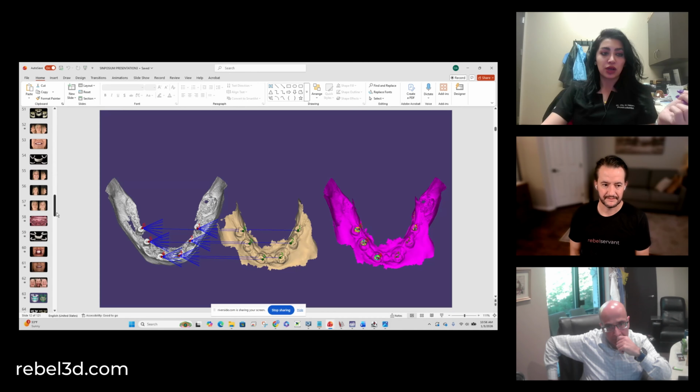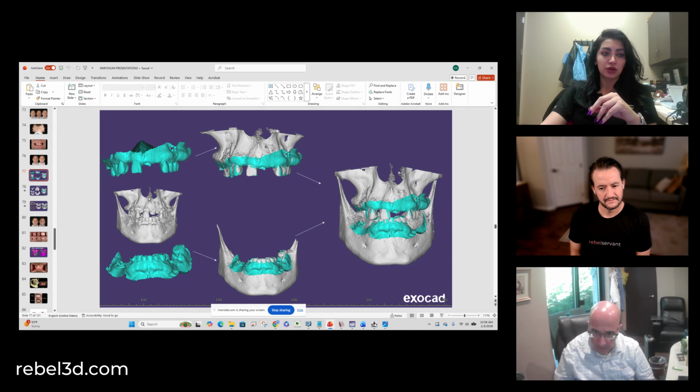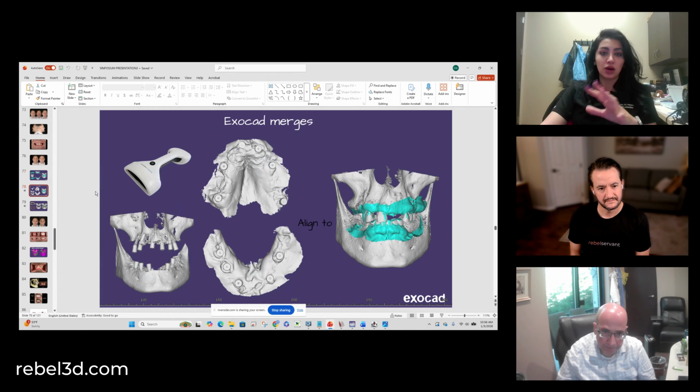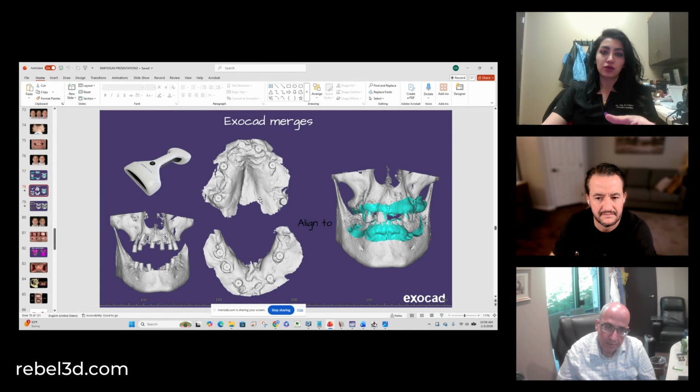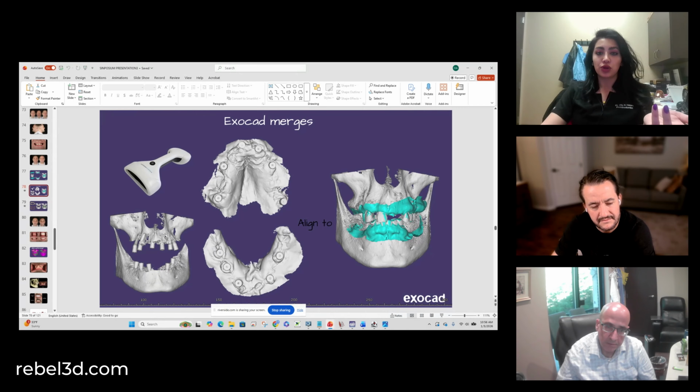So what I was mentioning here with the workflow, that you're segmenting the DICOM into an STL, taking those separately, merging them to your pre-op bite at the vertical dimension that you want. When the day of surgery comes, you do your surgery, prosthetically driven, of course, with dynamic navigation. You place your radio-opaque caps. They could be 3D printed, they could be titanium, the material of your choice, really.